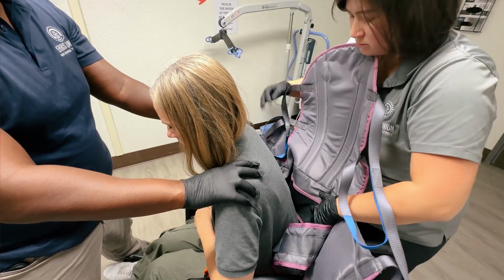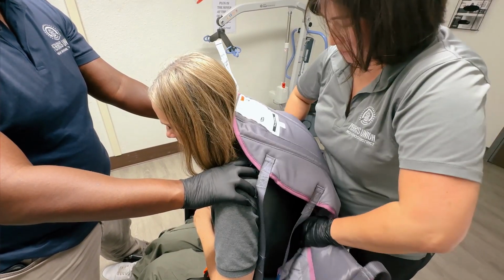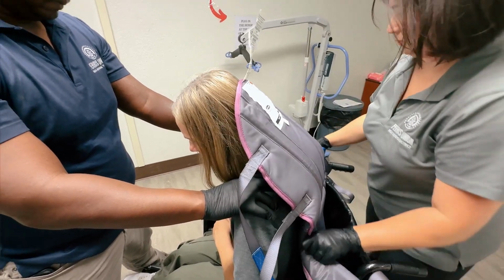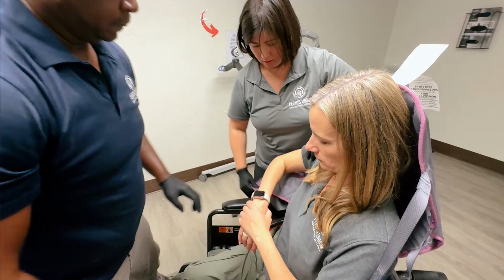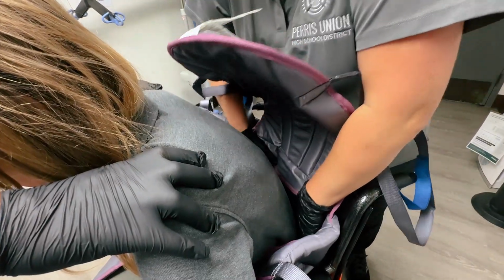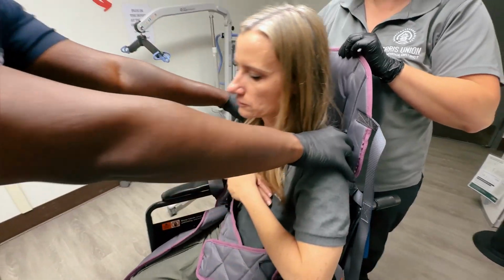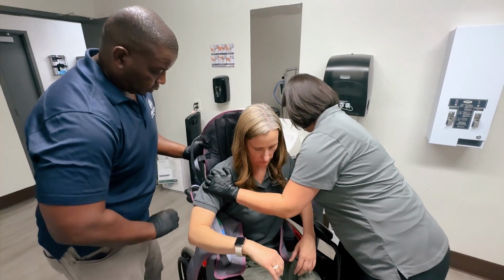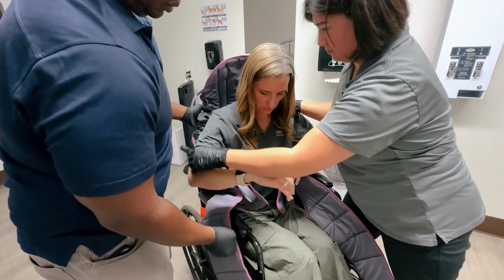Place the sling behind the student. If properly positioned, the non-slip mesh will be against the student's back and the fabric behind their head and neck for support. With the student leaned forward, push the back of the sling down towards the seat. The back of the sling should be positioned with the lower edge of the sling about the level of the waistband.